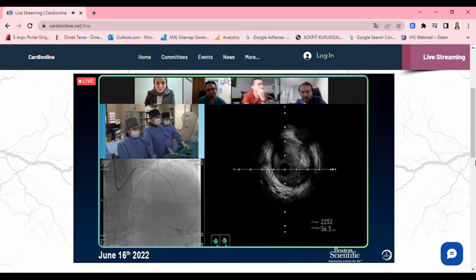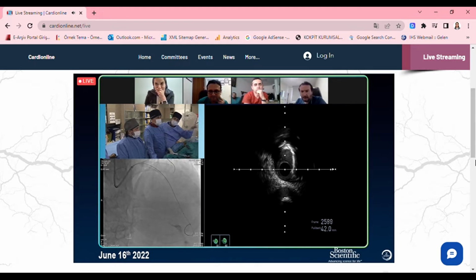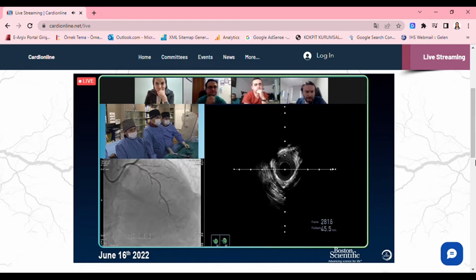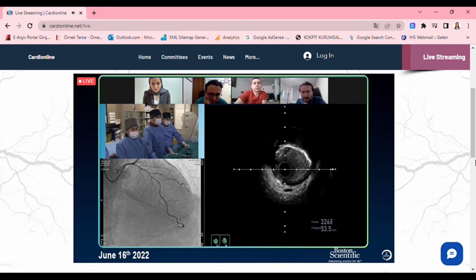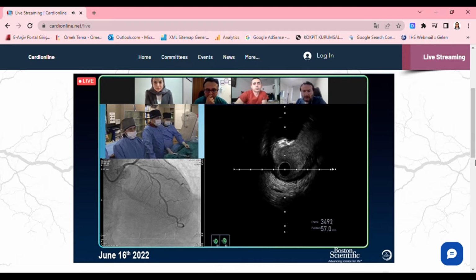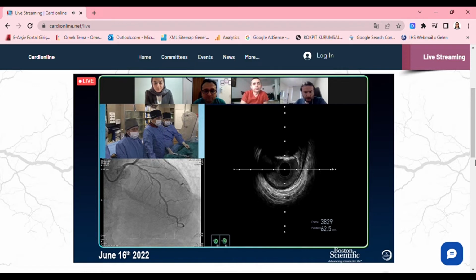Right, yes. And the diagonal is coming. Here we have heavy calcification. Here it is almost 360 degrees, so we have a very calcified lesion. Then we can't see much beyond the calcification. Right, a great example of acoustic shadowing from true calcification on IVUS. And I'm assuming you went all the way to the left main, which we're probably about to see in a second, just to see how significant the ostial lesion is.